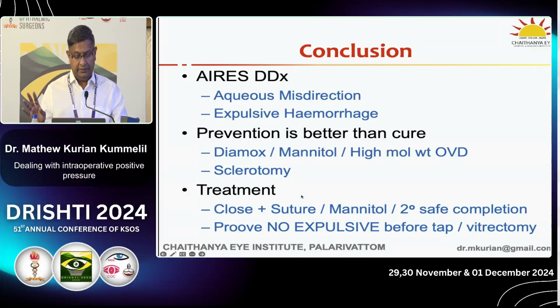fight to live another day. Okay, so don't try to be heroic that day. Close, put sutures on the main port, side port, everything. Put the patient on mannitol and plan for secondary safe completion either later in the same day or on another day. If you want to do any tap or vitrectomy, you have to have proof that there is no expulsive, otherwise you are in trouble.